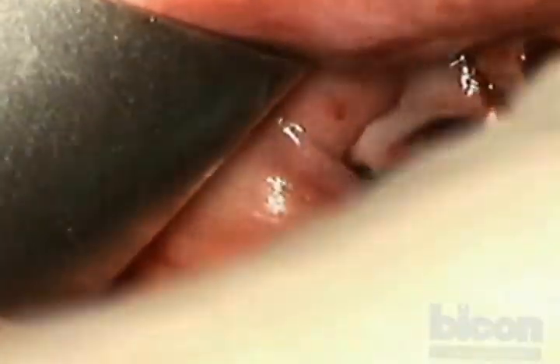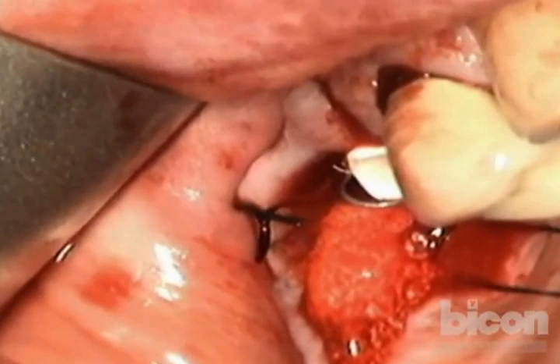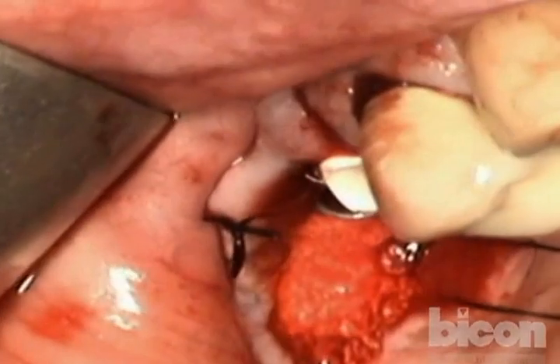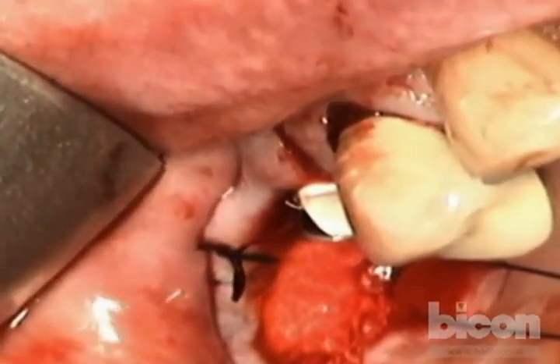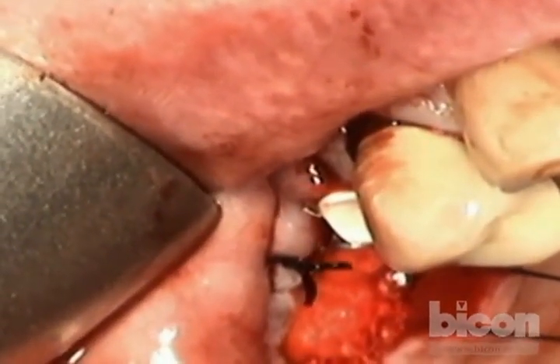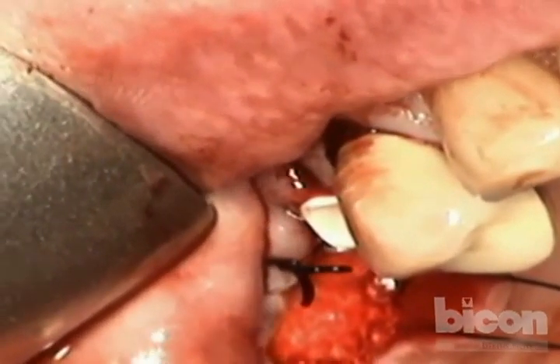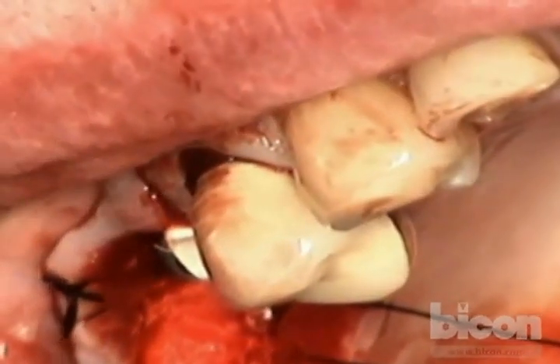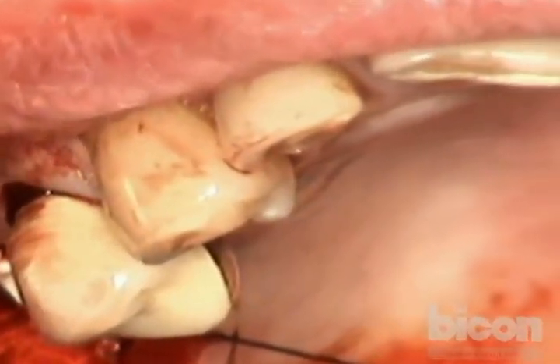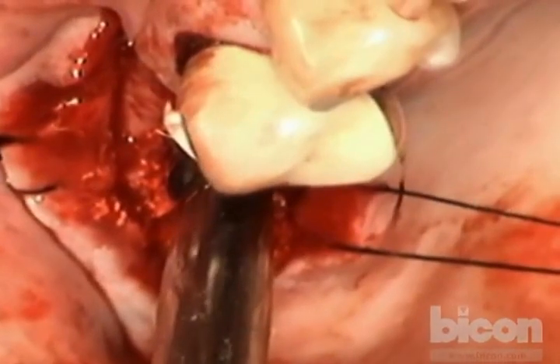Okay, I will stop shy of the full depth because I don't want to risk the implant floating into the sinus. Okay, for that, we take the sinus lift abutment, which we will then carry. This is a little bit too big. You can carry it with a rongeur or other carrying device, or you can just use the suction, which holds it very nicely and neatly. And we will put that right this way.